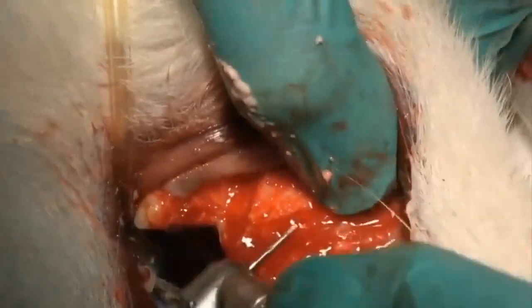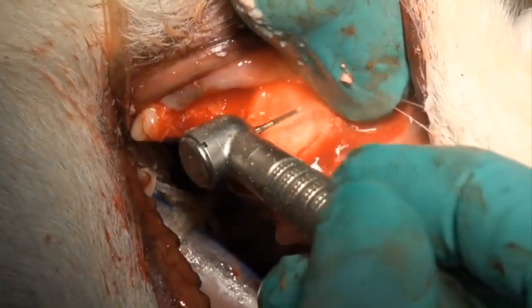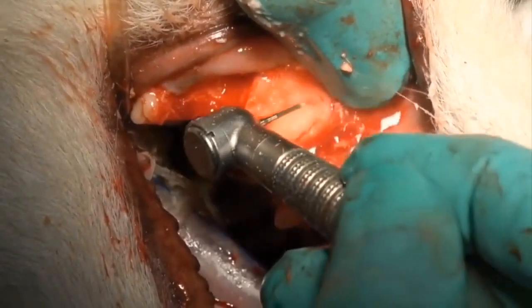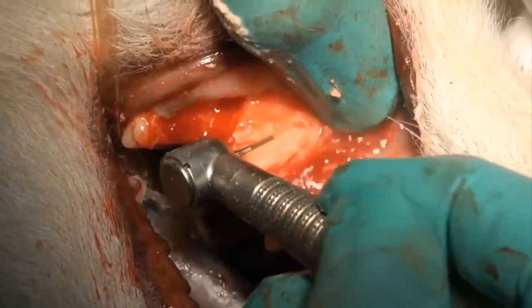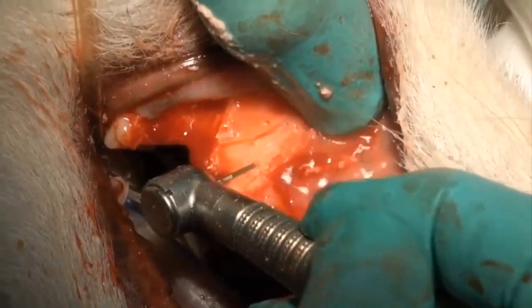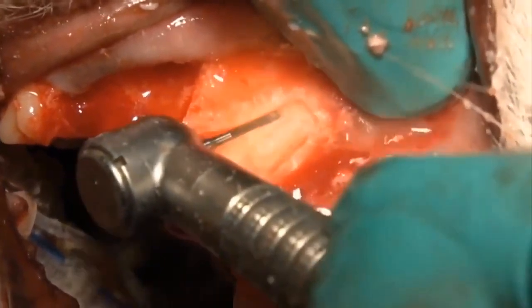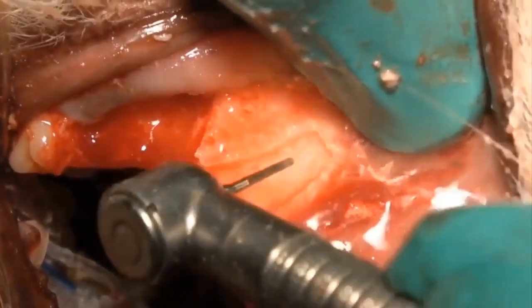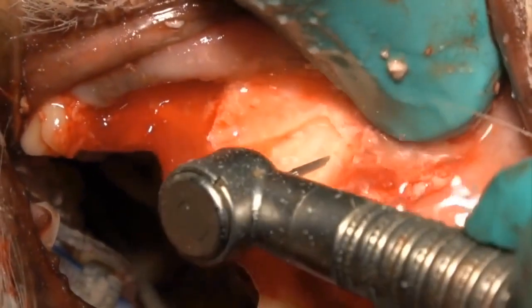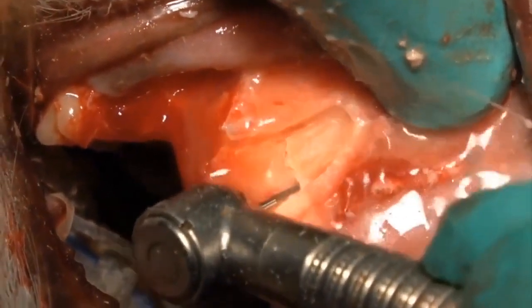What we need to do is come back here with our cross-cut tapered fissure burr and remove more of the vestibular bone, increase the groove depth on the distal and the mesial aspect. And as you see there, we're going up underneath on the coronal portion of the root tip just to release it from the bone a little further. Once we complete that, we'll be able to come in with our luxator and remove it.